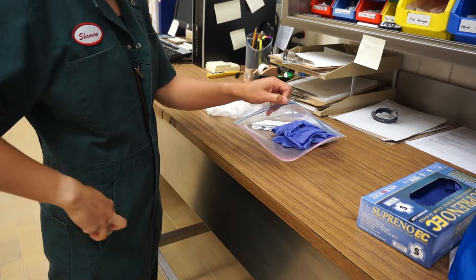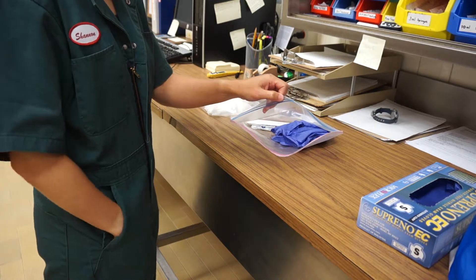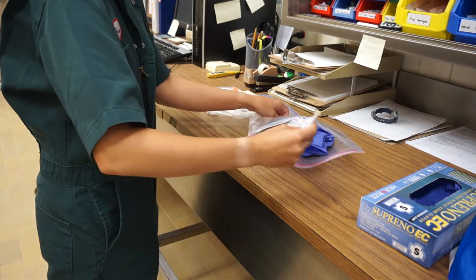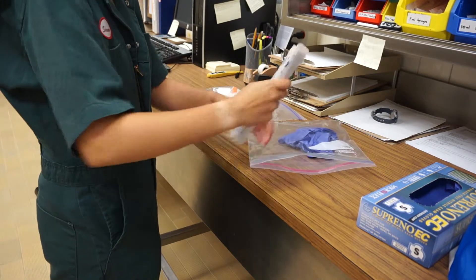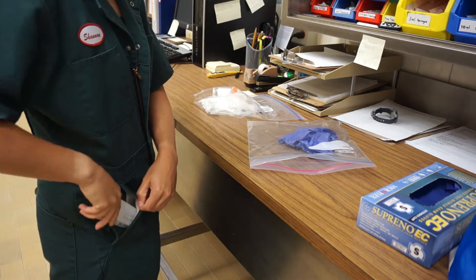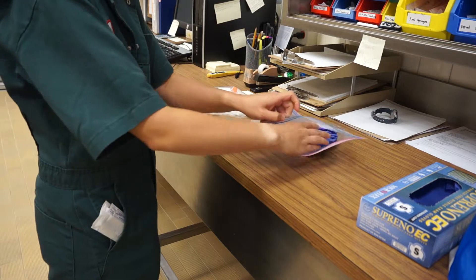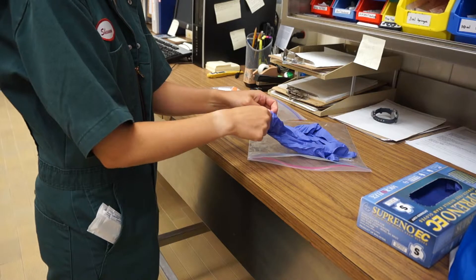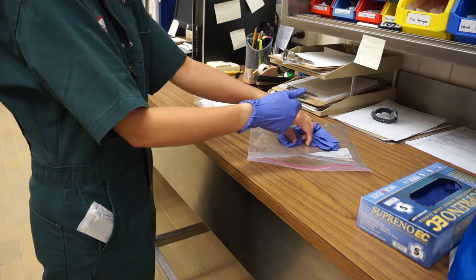In a clean area such as your office, put the wrap swabs and orange top container from the sampling kit in your pocket and put on the gloves. Make sure to leave the Ziploc bag in the clean area and try not to get manure on your gloves, the orange top container, or the Ziploc bag.